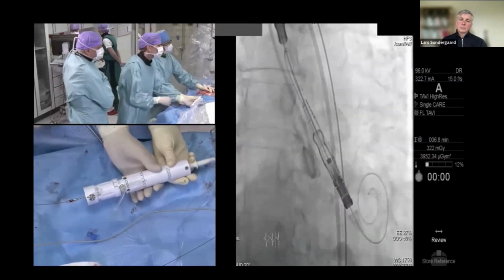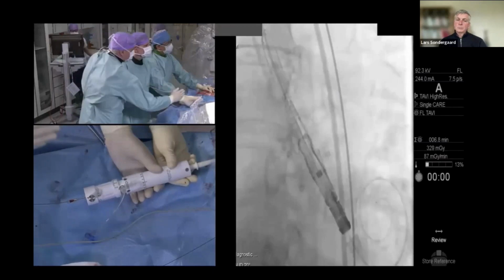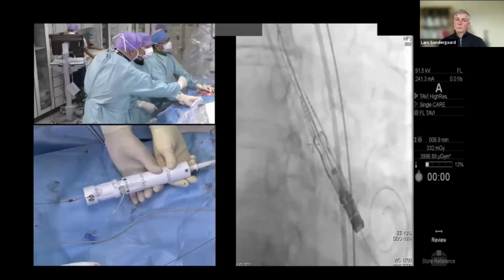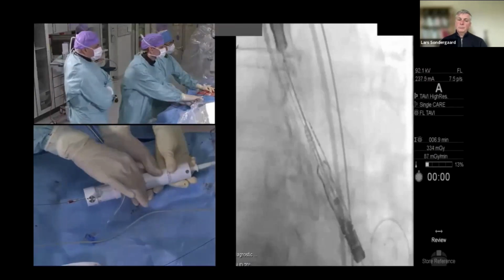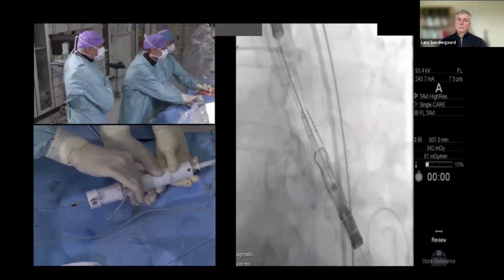I mean, you should go live again. Yeah, for sure now it is good. It looks good. And it's also important always to keep a forward push in the system. You should not drag it back. If you drag back, you need to go further back and then have a forward tension in the system. Okay, so we open up the upper crown now. Yeah. So knob number 1 is going to open the upper crown and the stabilizing arches. So it's a top-down deployment.